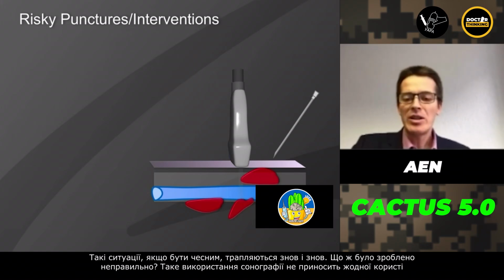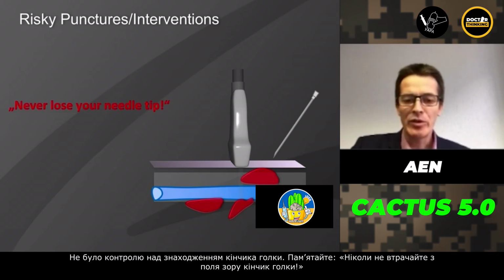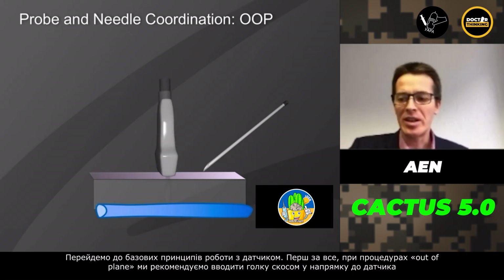Ultrasound as such doesn't really improve anything. In this case, there was no needle tip control. So remember, never lose your needle tip. And for this, we need methods how to actually achieve this. Let's go over some basic probe handling methods.